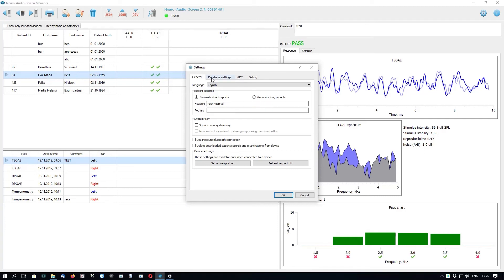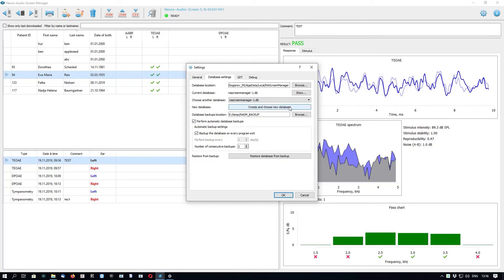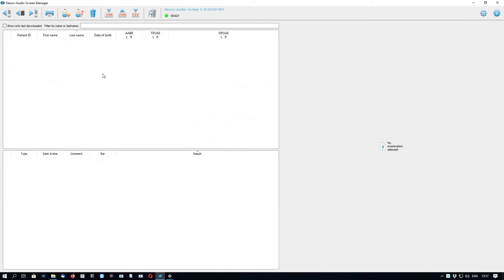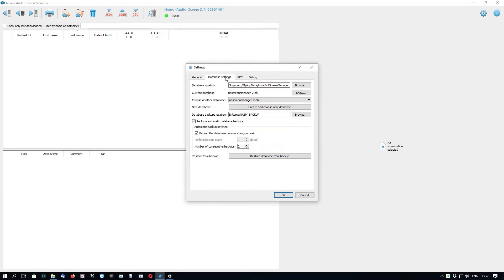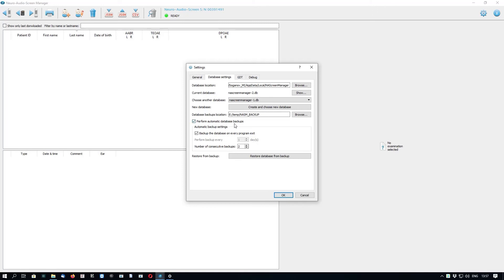In the Database Settings tab, you can create a new database and choose it as default. When you click OK, the patient and exam tables will be cleared because you switched to the new database. You can also choose another existing database to use. Additionally, you can set up the database backup location and customize automatic database backups by enabling the checkbox. You can configure backup to occur on every program exit, or set the number of days between automatic backups. To restore from a backup, click the Restore from Backup button.